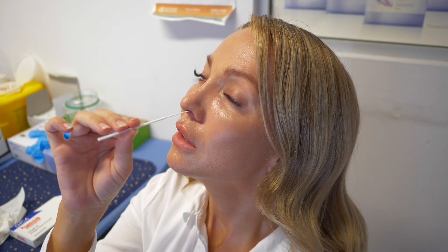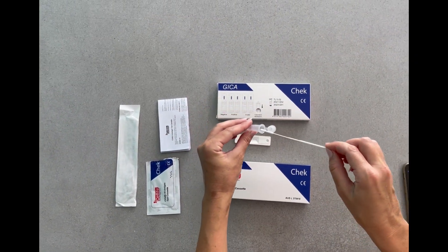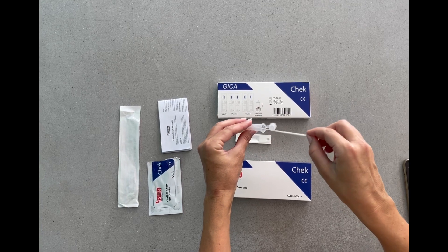The user must wash their hands immediately after the test is complete. After taking the sample, rotate the swab inside the tube for 10 seconds.